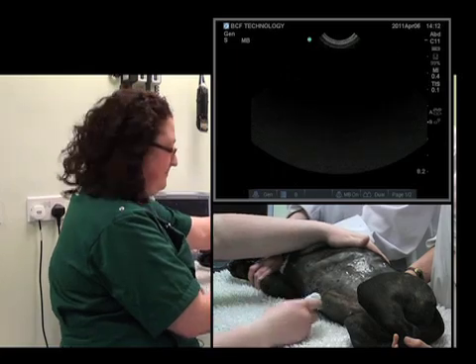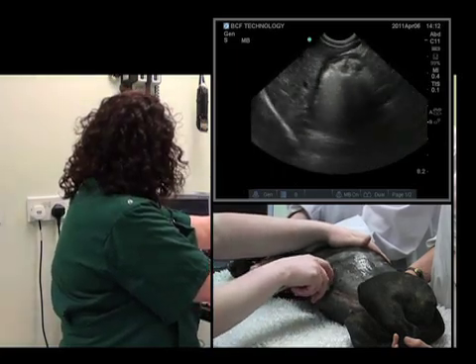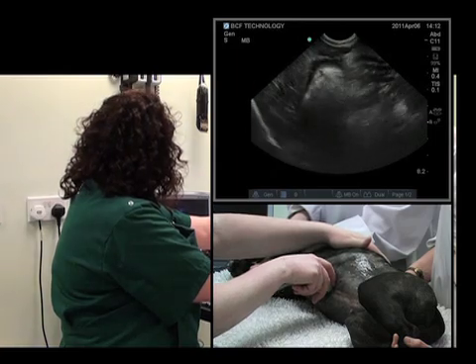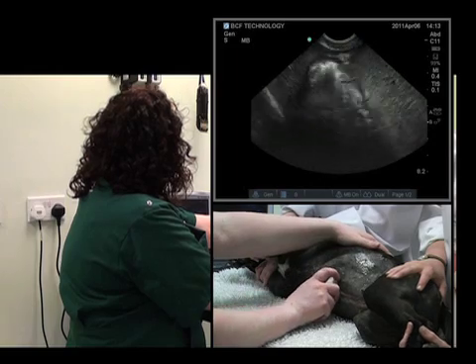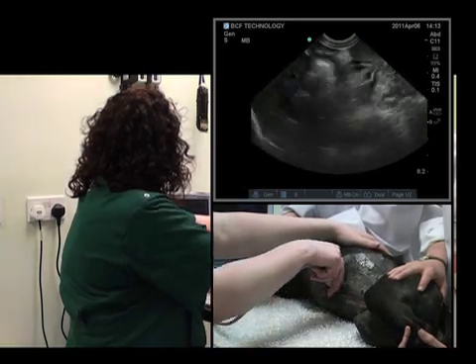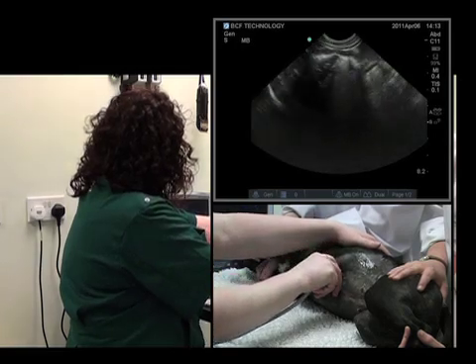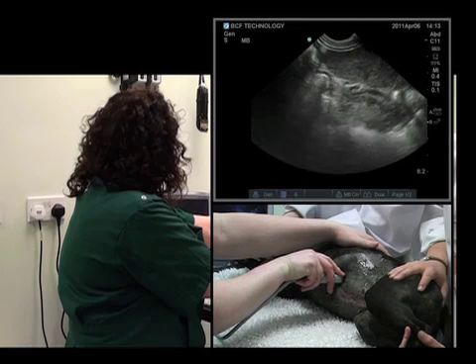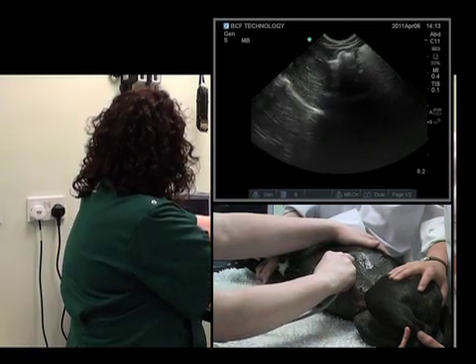We'll do that one more time — start at the level of the xiphoid sternum, just caudally to the liver, and we'll fan up and down through the pylorus, back to the middle, then rock caudally for the pylorus and cranially for the fundus.